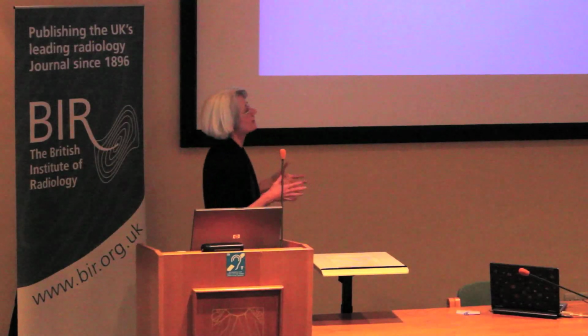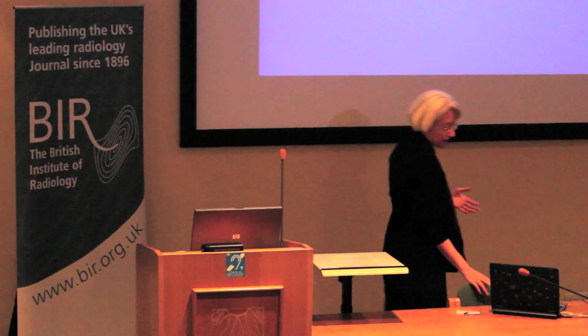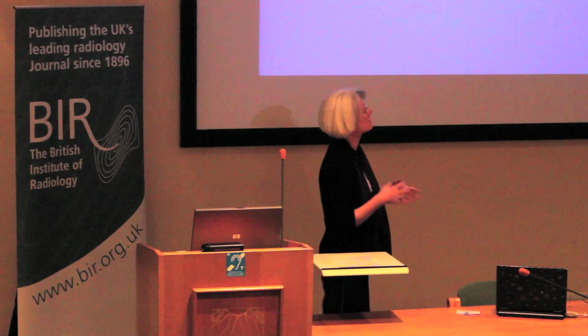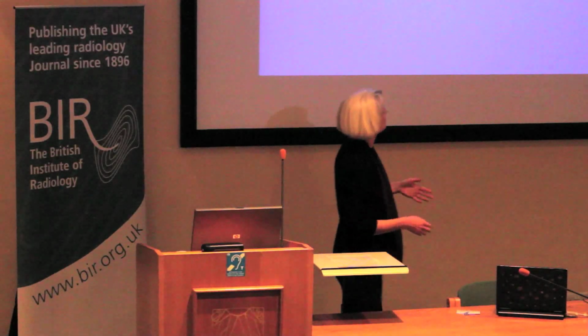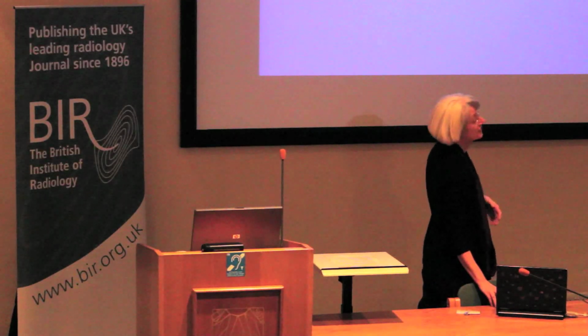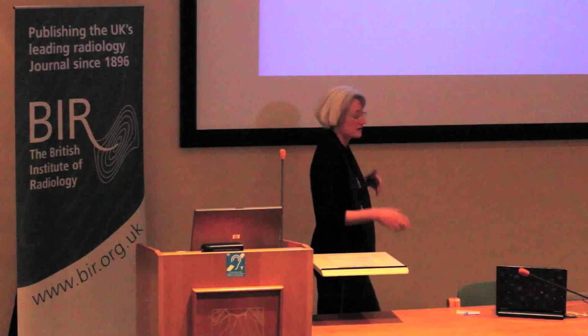So this is looking at how the RF is distributed in the fetus, but it assumes normal heat loss mechanisms. We say safe SAR levels, safe RF deposition levels, are okay. SAR levels have been defined for the adult. The question is, do they count for the fetus? These levels have been defined assuming that the adult who goes in the scanner can lose heat.